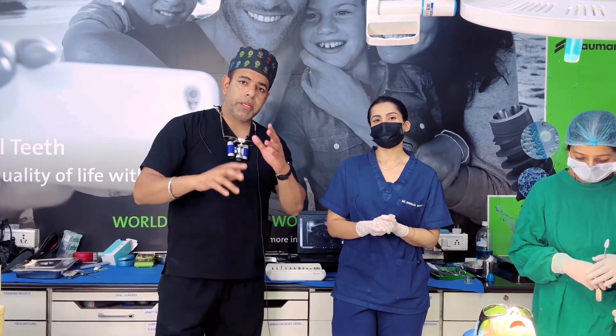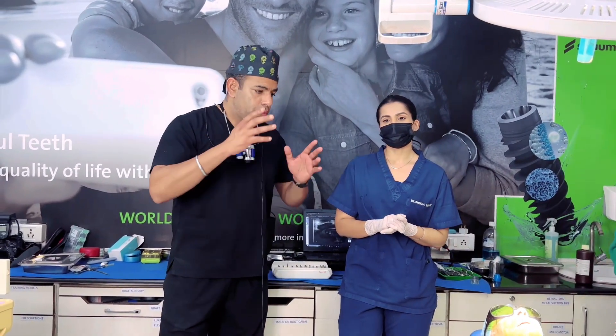Dr. Shinja, who is the oral and maxillofacial surgeon, is on her second day. After that, she is going to be placing her implants. So this was her first case.